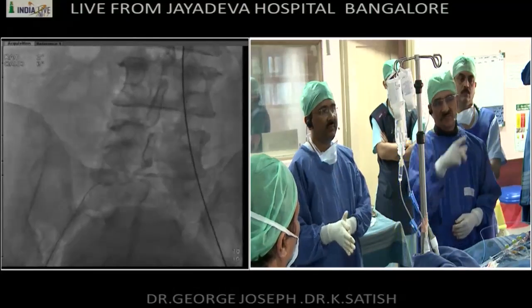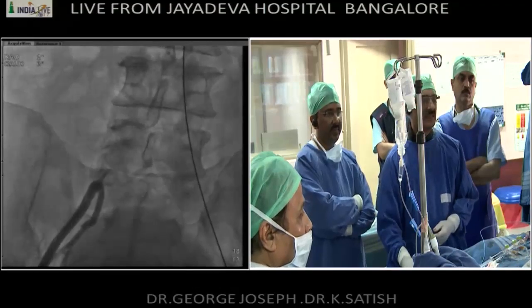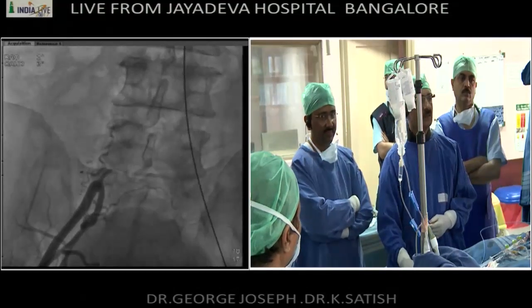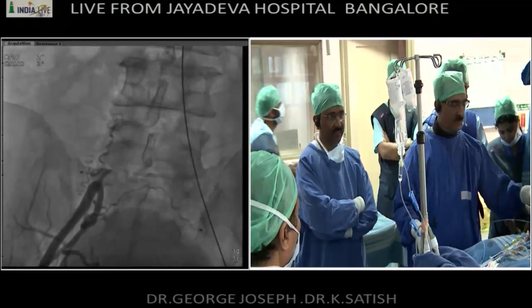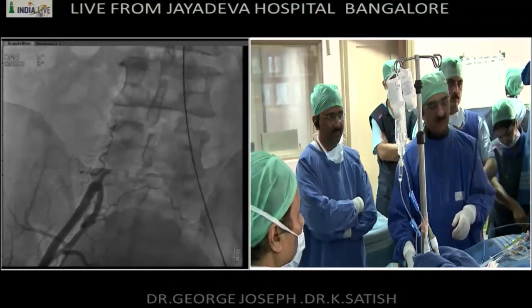It just went up to that iliac bifurcation. It felt as usual. We didn't enter the CTO. No, it didn't enter the CTO. The J wire which we used to put the sheath in. We didn't advance the sheath fully at that stage.